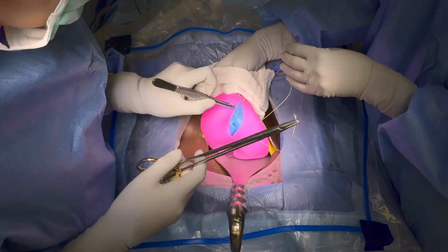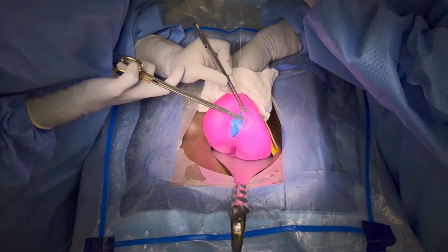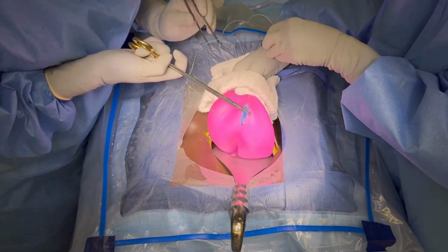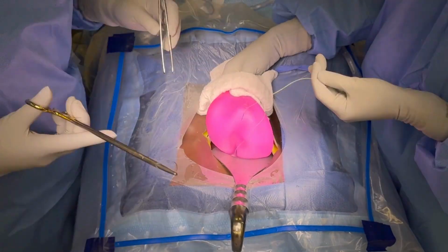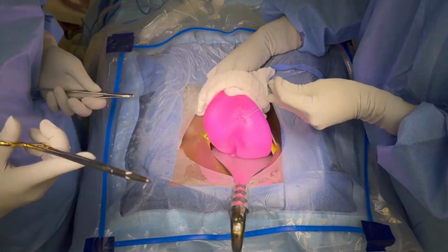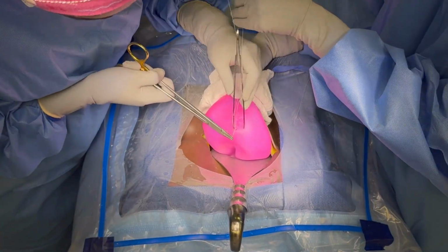The patient is at most risk for blood loss during the time of multi-layer uterine closure. During this point in the cesarean section, it is imperative to communicate with the anesthesia team that Pitocin has been given and if any additional uterotonic or blood products are necessary. The surgical assistant may be helpful at this point in assessing uterine tone for need for uterotonics.